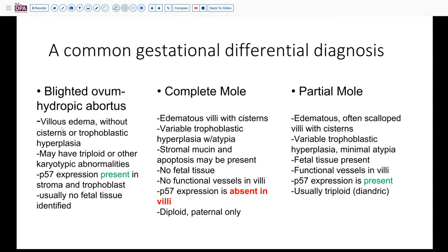In fully developed cases, there can be differences. But sometimes, especially in these early first and early second trimester contents, they're less well developed. Villus edema can be seen in a hydropic abortus as well as a complete mole and a partial mole, so it's not specific. In general, partial mole tends to have more scalloped villi, and cisterns tend to be more common in molar pregnancy than in a blighted ovum.